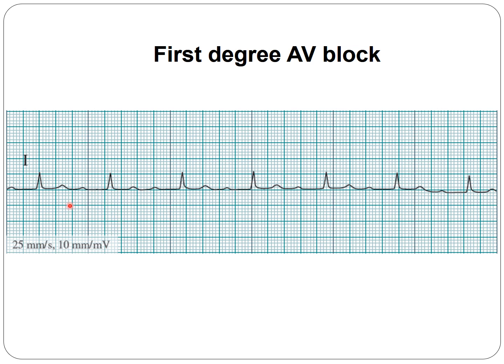As seen in these tracings, we have regular rate and rhythmicity — the rate is around 70. We do have P waves that come regularly. Marking the PP interval and shifting it confirms that every P is generated rhythmically in the sinus node. However, the conduction through the AV node is longer — from the beginning of the P wave to the beginning of the QRS, it's longer than 0.2 seconds; in this case, approximately 0.35–0.36 seconds.